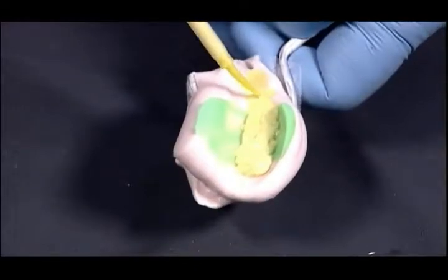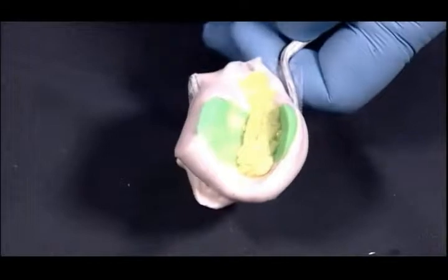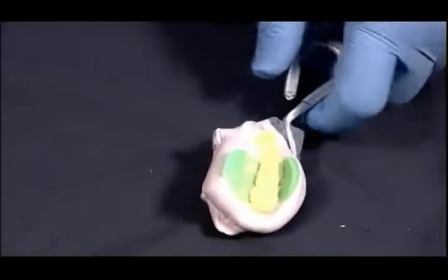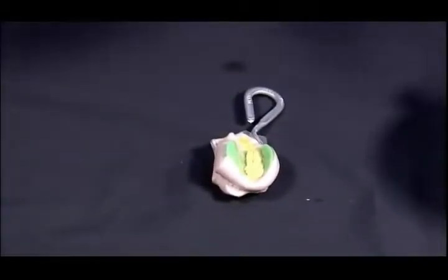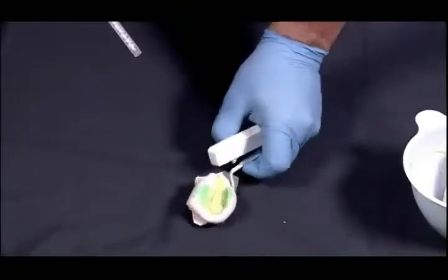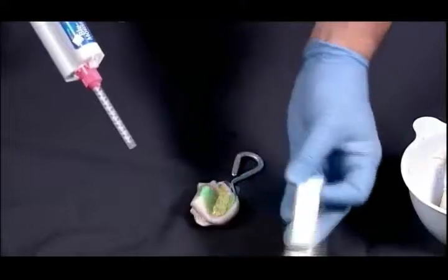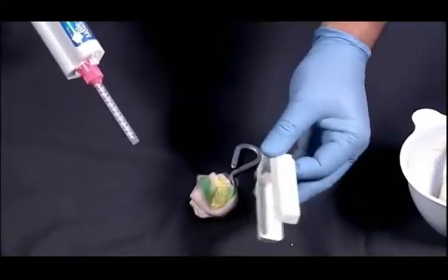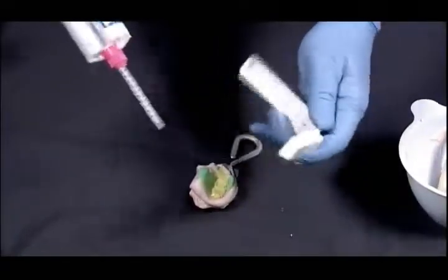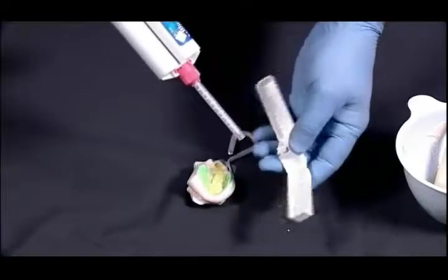I'm looking back here, you can see that it's almost set at the front portion where I started. That's the cue for me to go to making an articulated model. So we have one side of it done already with the die material. It is very accurate. Then we're using something called the die maker articulator that gives us a quadrant articulator, dual arch, and we will be pouring up some good vinyl polysiloxane bite material, but it's a super fast setting.